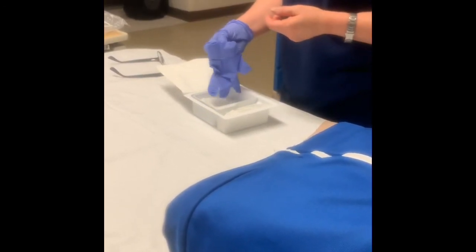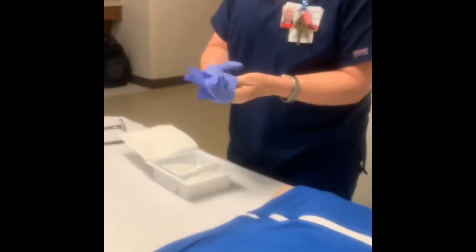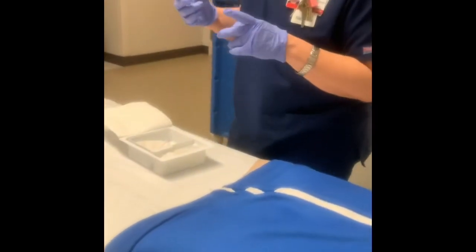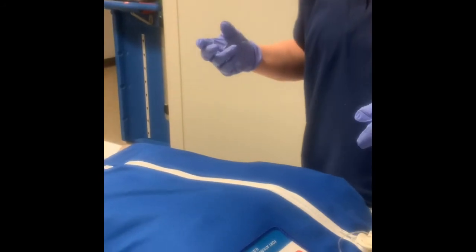Do y'all ever clean trachs much? Not too much. Not really. Yeah, the important thing is they have to stay clean because of the crust that builds up, and the other thing you're going to deal with is the inner cannula can get pretty messy.